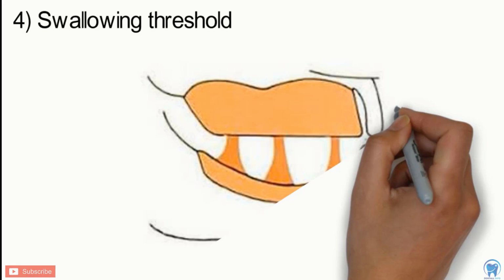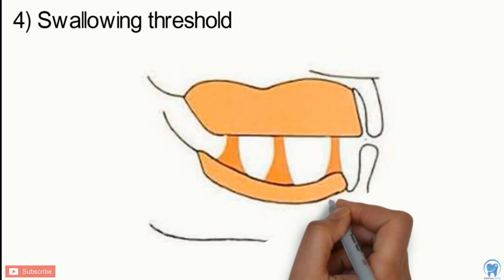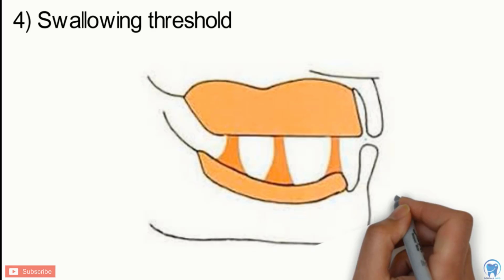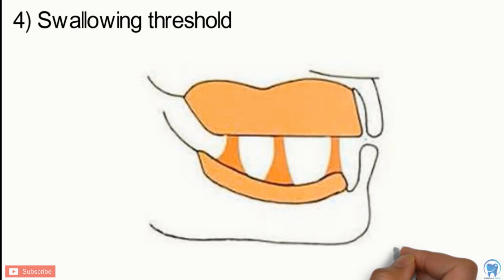The flow of saliva in the patient's mouth is increased by food, such as pieces of candy. Repeated action of swallowing the saliva will gradually reduce the height of the wax cones to allow the mandible to reach the level of vertical dimension of occlusion. The length of time to complete this method and the relative softness of the cones will affect the results.